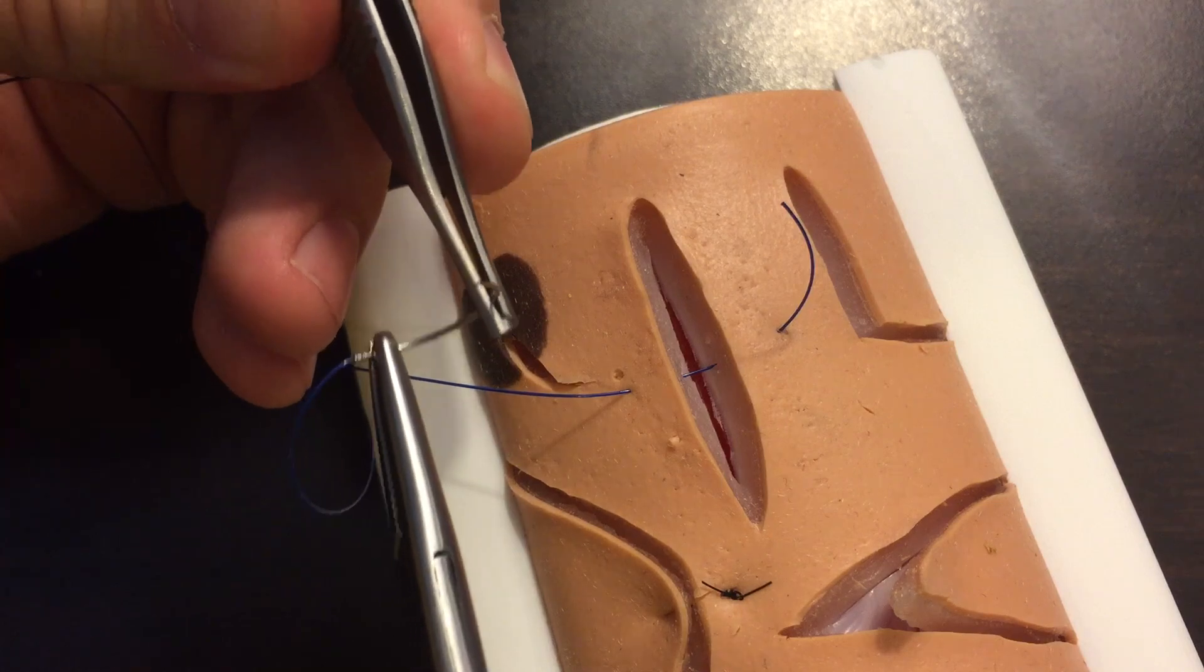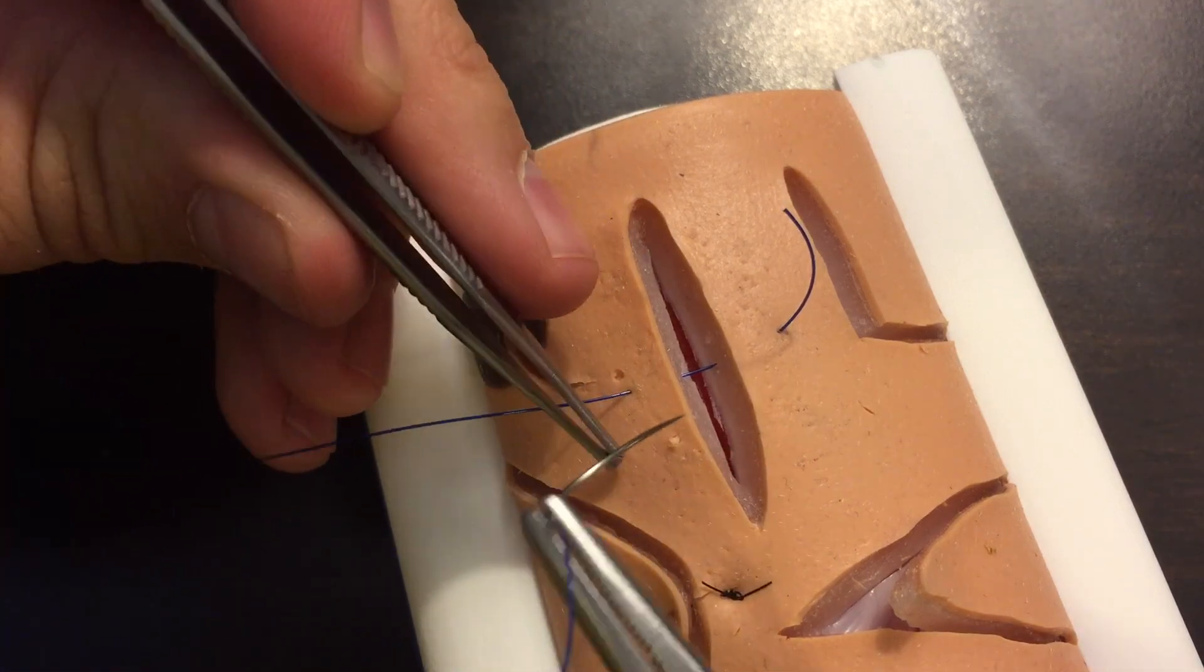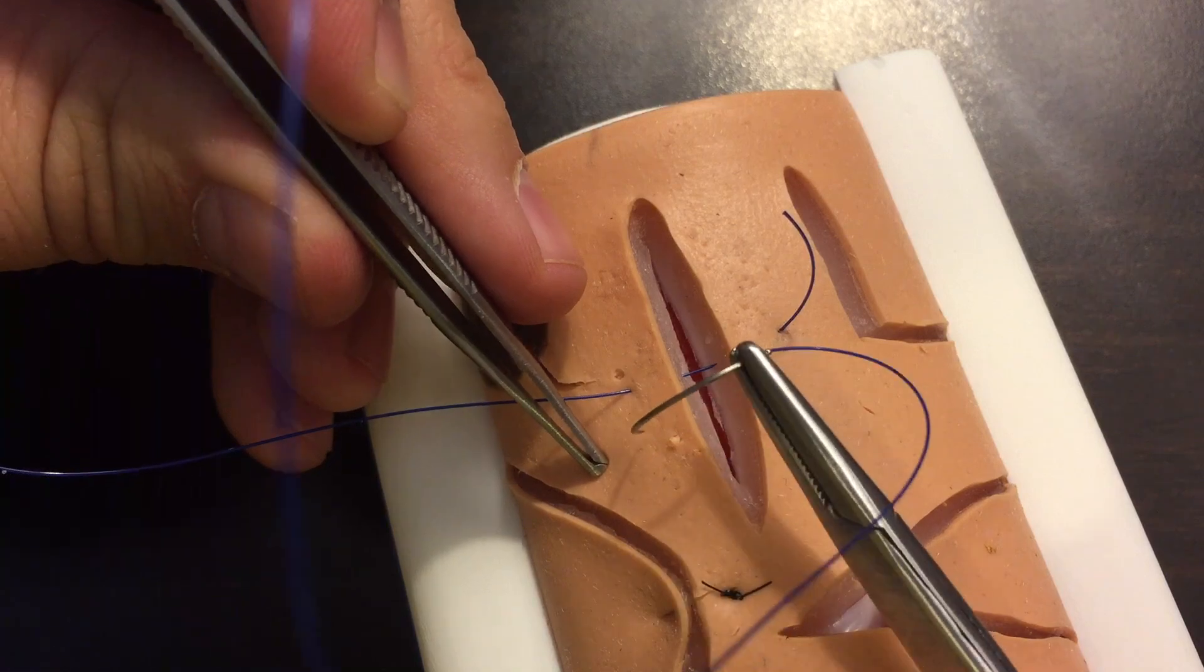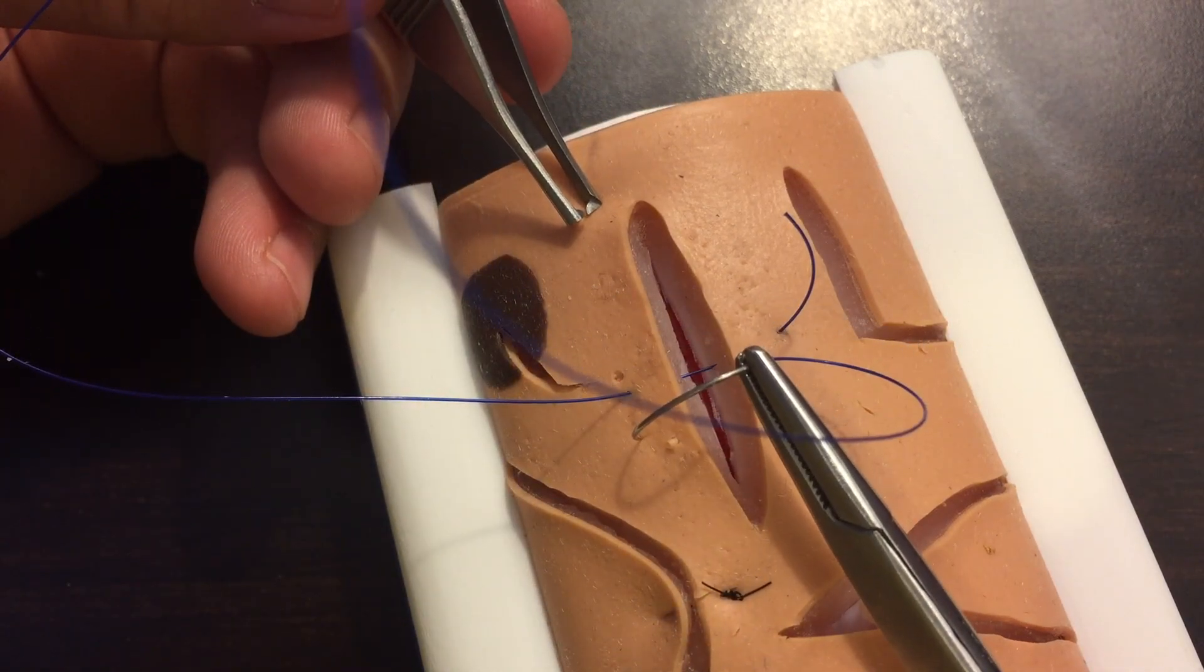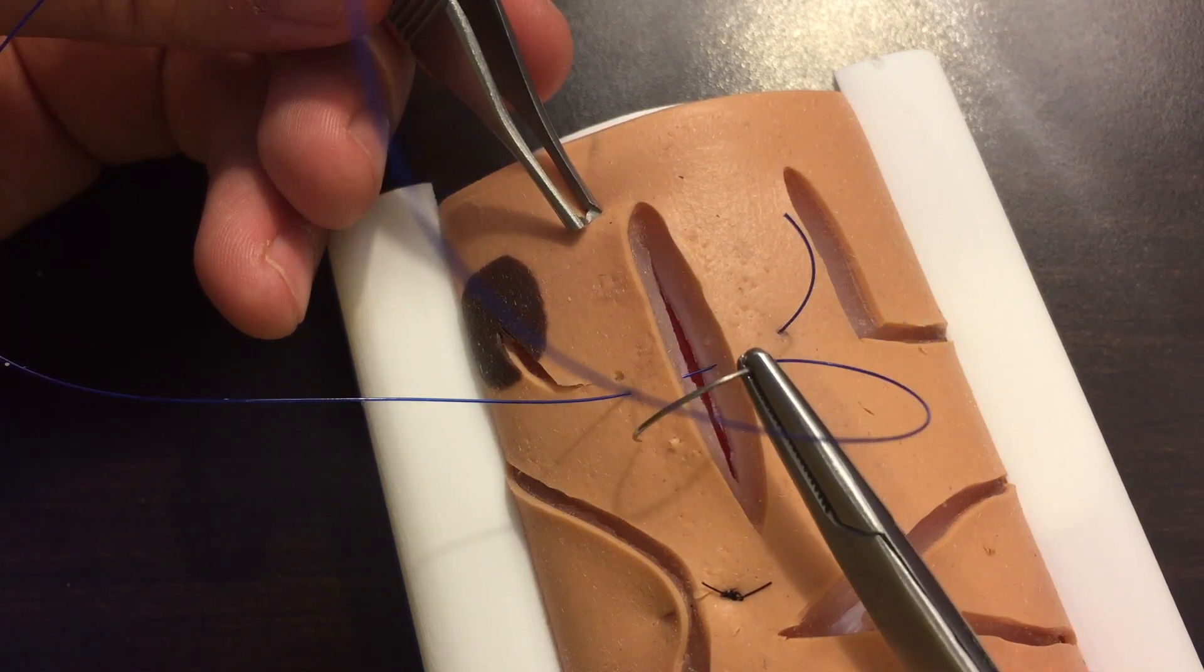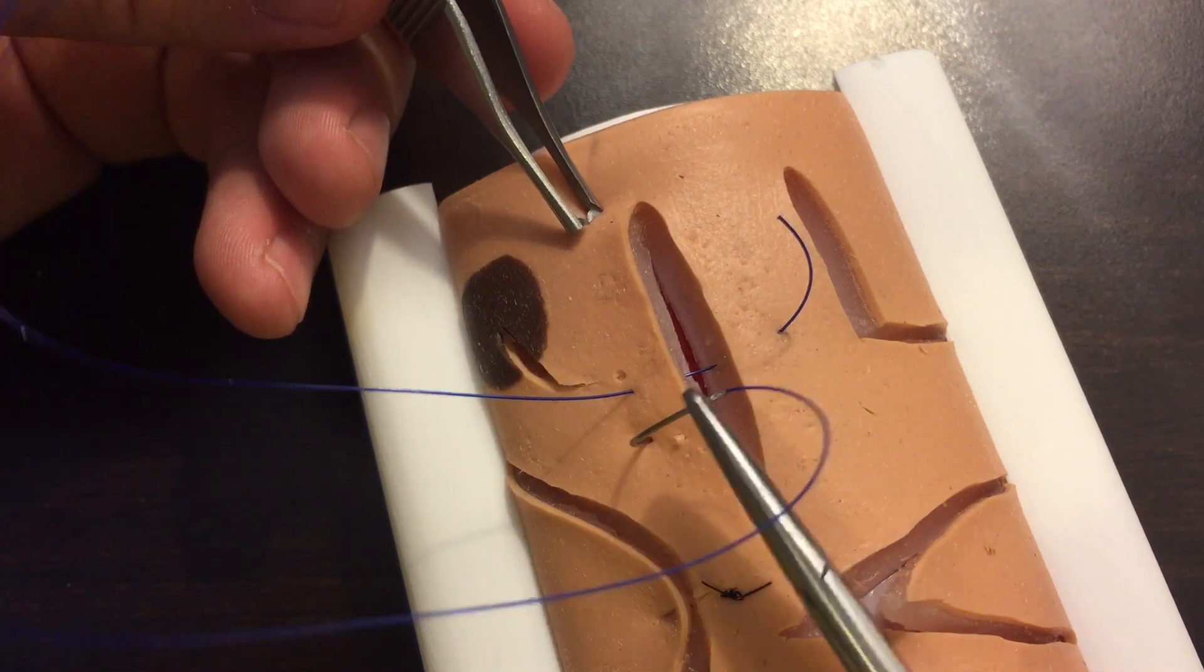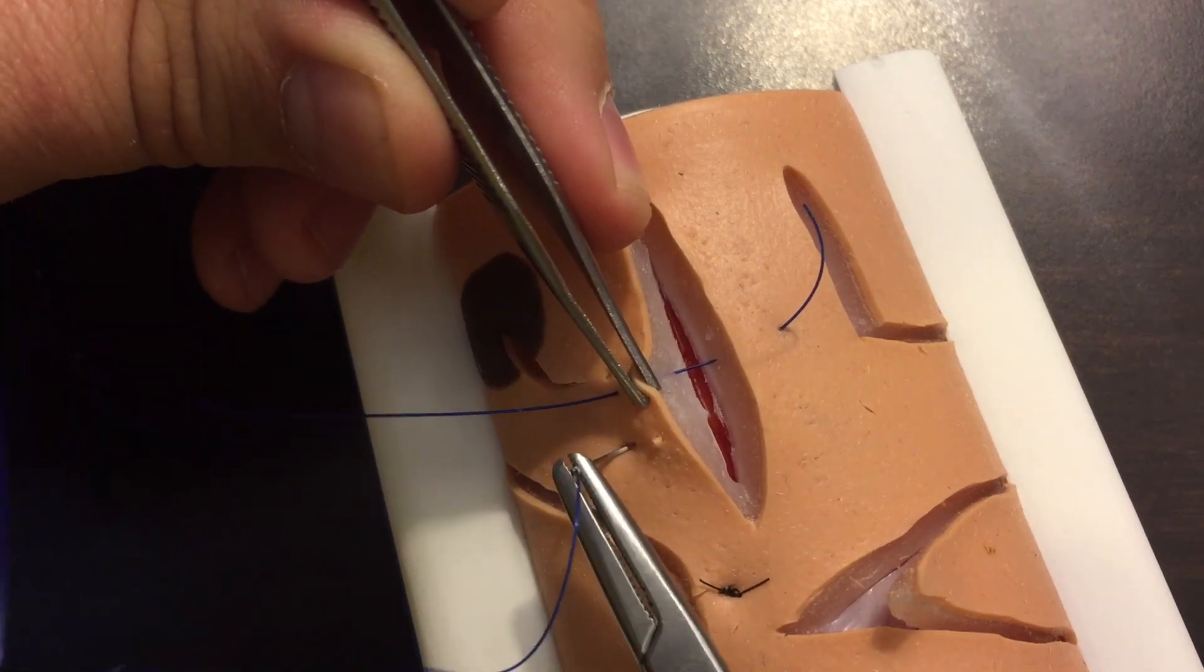I need to take a bigger bite, so you're going to be entering again the skin on this side, but you're going to enter the skin just a little further down on the laceration, the same distance that you exited on the first pass. Equidistant, 90 degrees again.